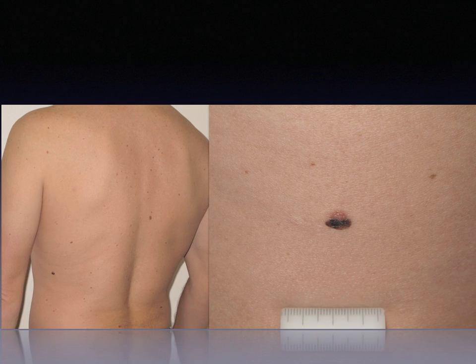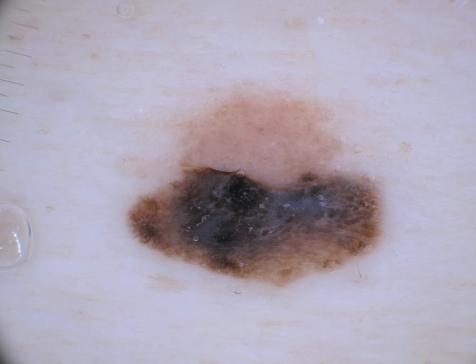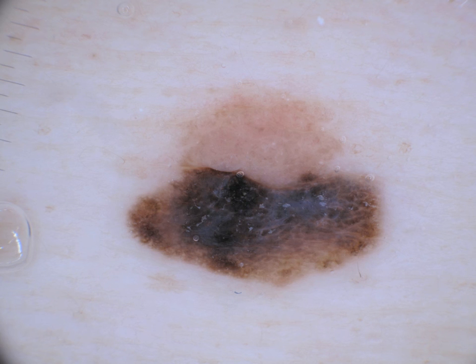This is an example of melanoma arising on a nevus in a patient with multiple nevi, where the melanoma is arising in association with the more banal-looking nevus of this patient — a very common dermal nevus. In dermoscopy, on the upper part we see the nevus component characterized by a homogeneous light brown pigmentation. On the lower part we see the melanoma component characterized by atypical network, inverse network, and blue-white veil.